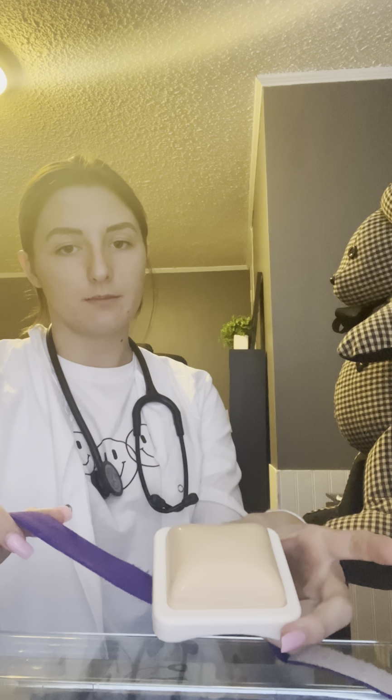I just want to mention this prior before I get the video started. My patient is a teddy bear, so I'm going to be using my skin injection pad down here because I can't get it wrapped around the teddy bear, but I will identify the locations and the areas where the injection should be at.